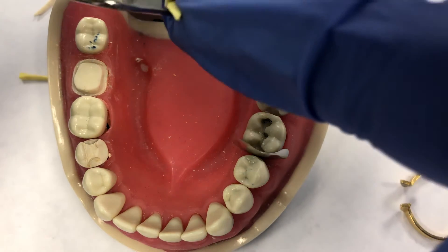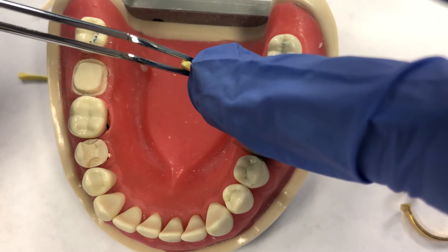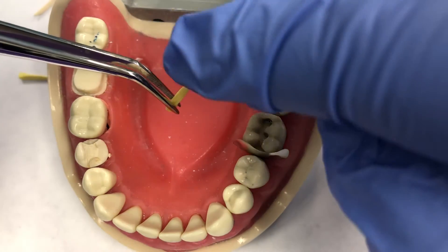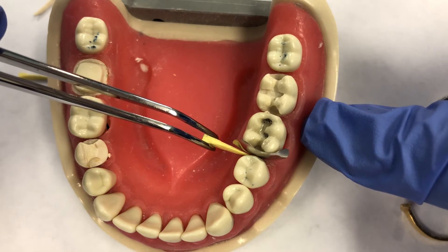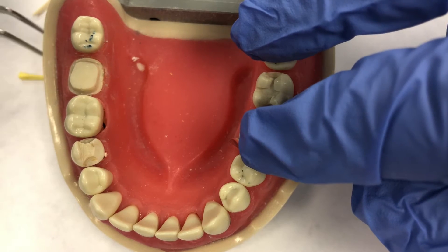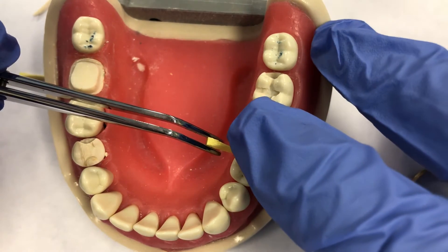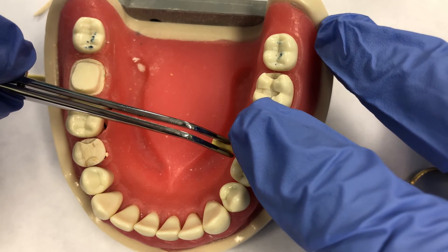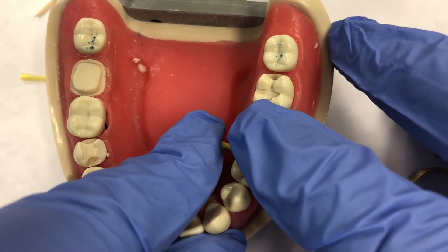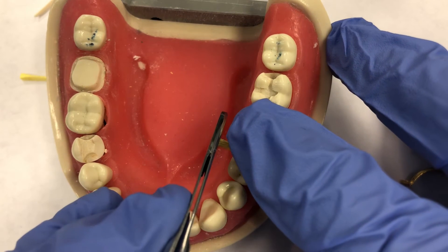This is a wooden wedge. It's triangular in shape, and that triangle mimics the interproximal space. The base of the triangle goes against the gingiva, and the curve of the tip should curve away from the gingiva. Before I start pushing, I want to keep a finger over the matrix piece so that it doesn't pop out. When you're putting a lot of pressure with a wedge, it tends to push the matrix out. I'm going to start by pushing with my cotton pliers. Once it's partly in, I can continue pushing with my finger, or you can use the end of your cotton pliers and give it a nice firm push.